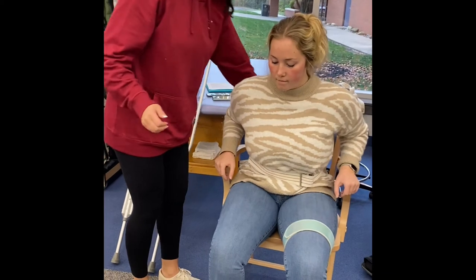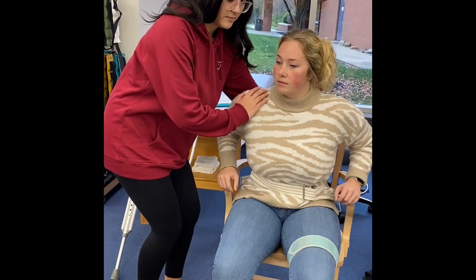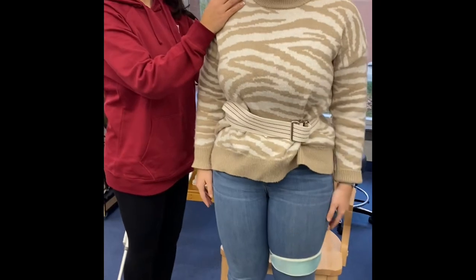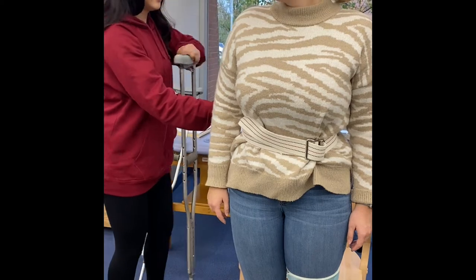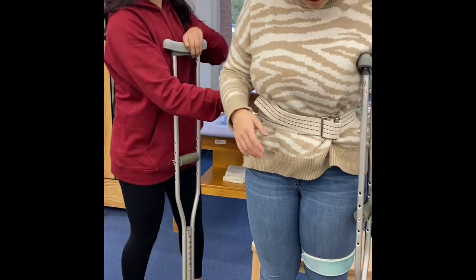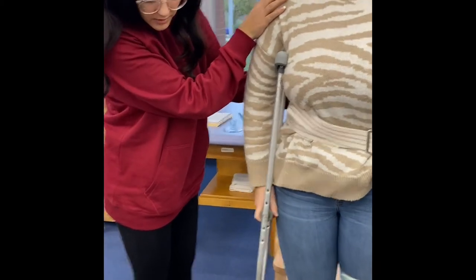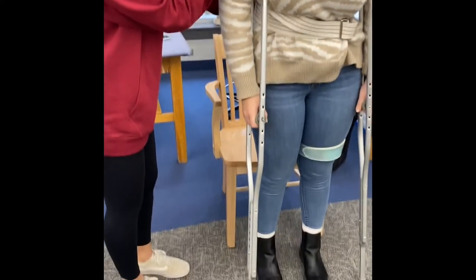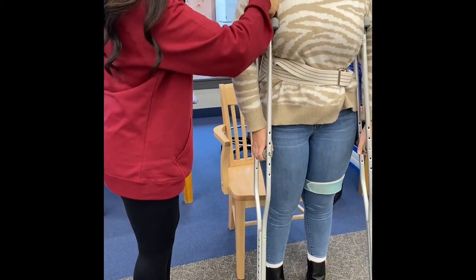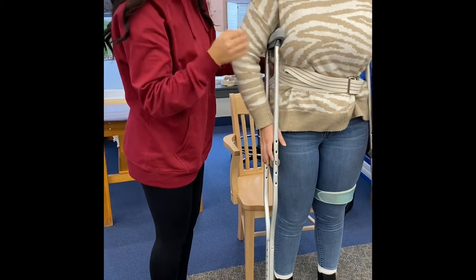Is that okay if I place my arm behind you? All right. So then on three, we're going to stand up — can I place my arm on the wall? So we're going to get you set up on three, push through your legs, and close up your arm. And then I'm going to measure with my hands. I can get about four fingers in there, so we're going to sit her back down and get her measured again. So I'll see the crutches from here.